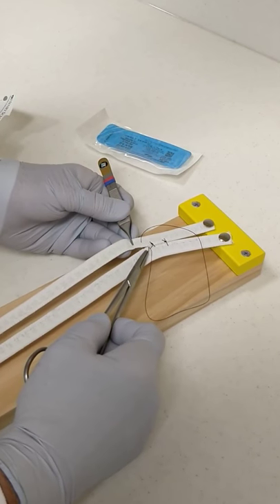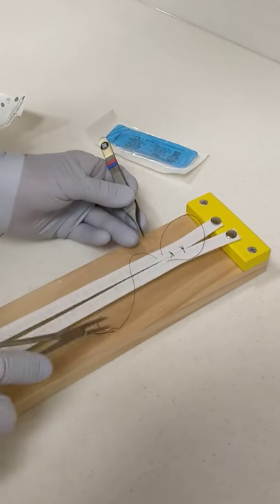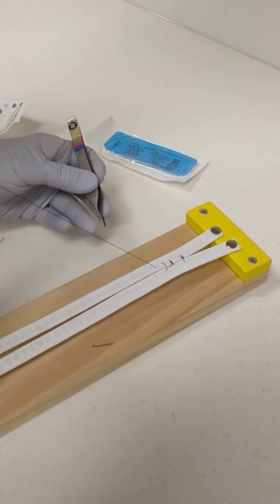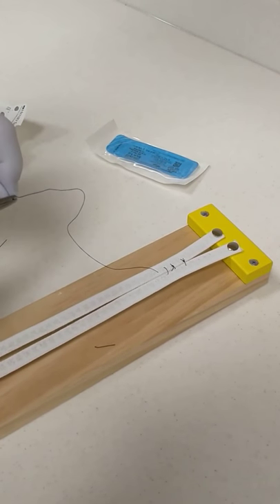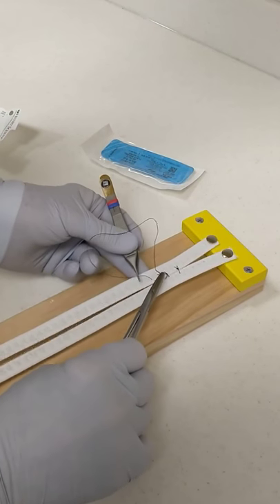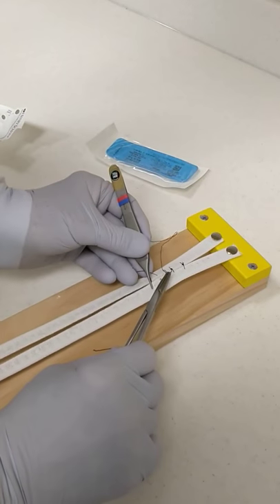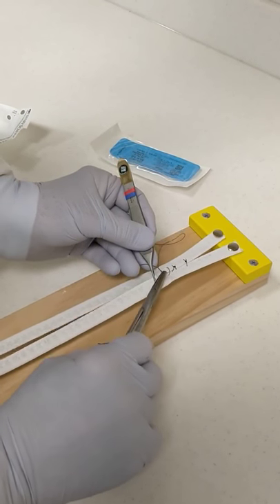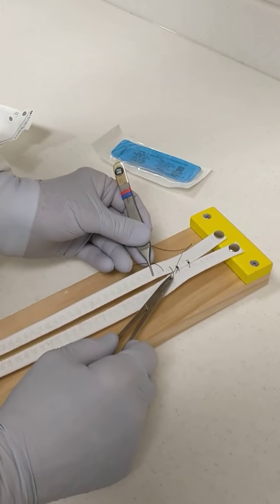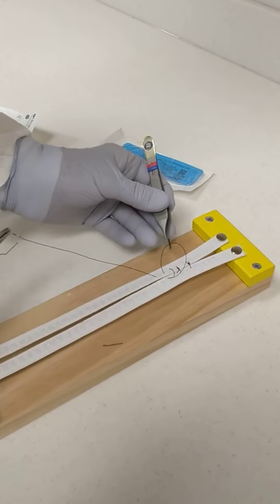And then, you advance the next stitch. Like that.